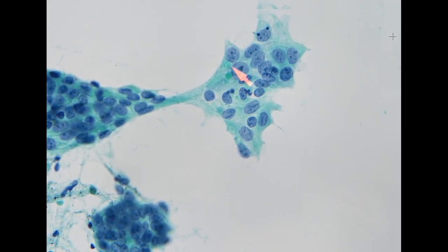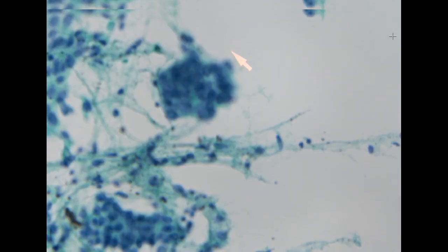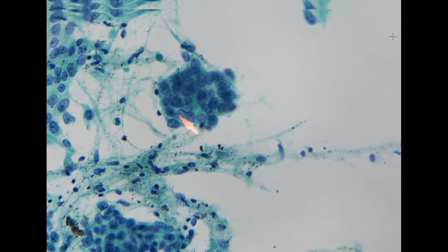So here we have a definite 4:1. We have a big difference in size within the same cluster. And here we have tightly overlapping glandular cells with very irregular arrangement, and most of the cells do have prominent nucleoli.